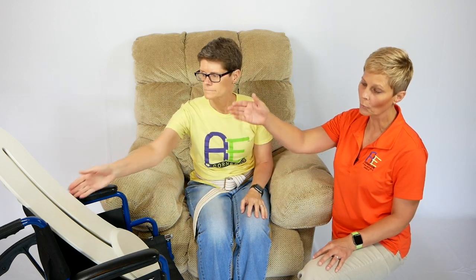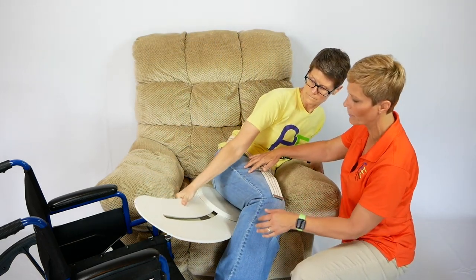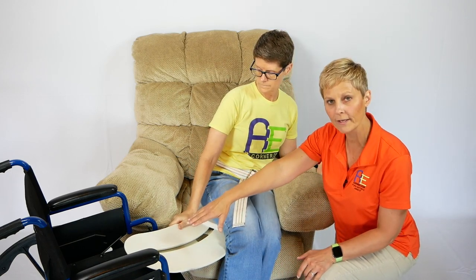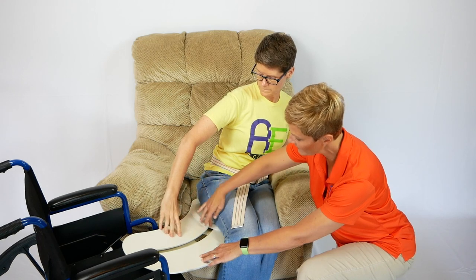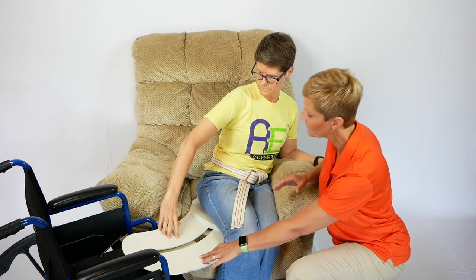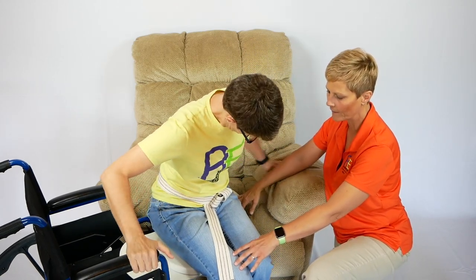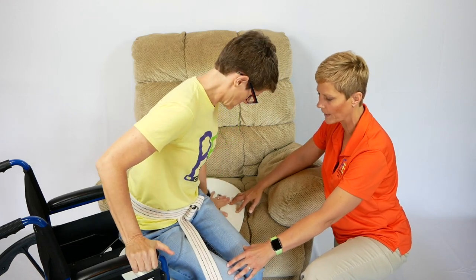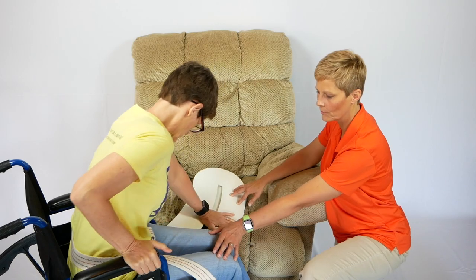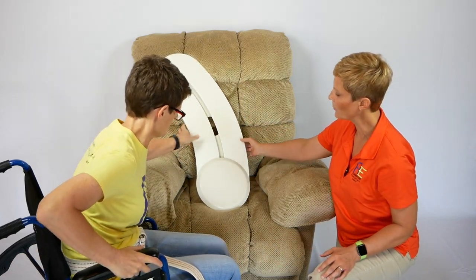Now let's look at the reverse — going from the recliner back to the wheelchair. Christina is going to lean over to the side to place the BZ board underneath her thigh and buttock, pointing the end of the board toward where we're wanting to go. We want to see the front edge of the BZ disc still exposed. Even though this is slightly uphill, she uses her arms to let the disc slide up the board as she turns into the chair, then leans away to pull the board out.